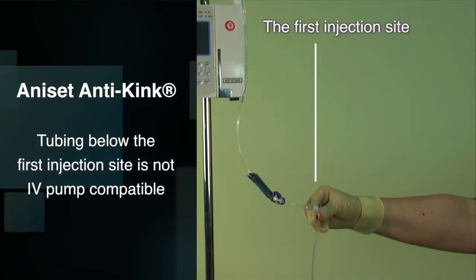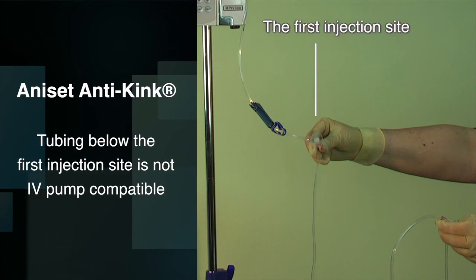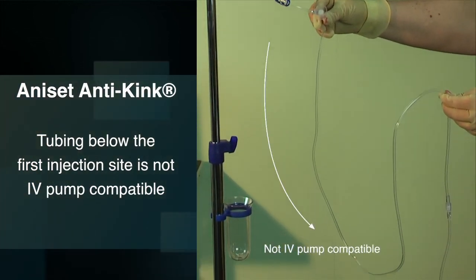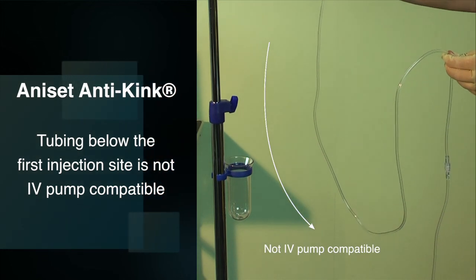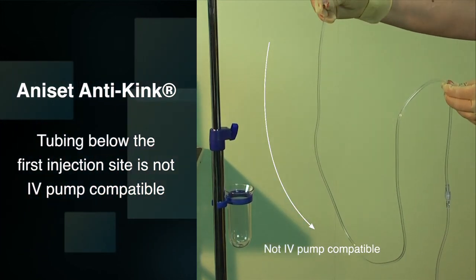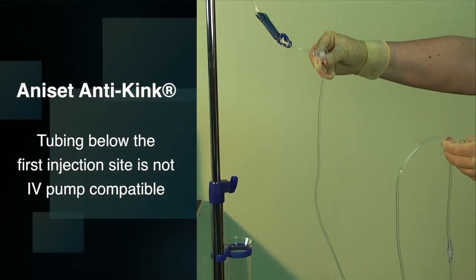The remaining length of tubing below the first AniSet anti-kink injection site is not IV pump compatible. Attempting to place and run the IV pump with this tubing will cause an IV pump error, will not deliver the fluid correctly, and may even completely occlude.